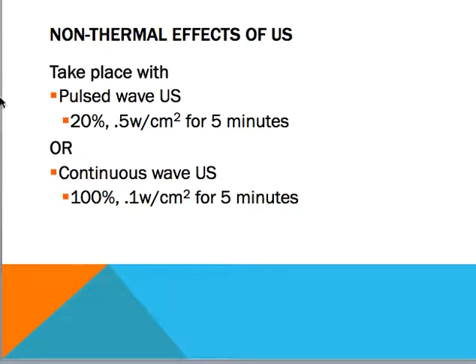And you should memorize this. If you're going to start using pulsed wave ultrasound with a patient, you would start with these parameters. Or if you have a machine that does not allow you to establish a pulsed wave at 20%, you can use a continuous wave, which is 100%, and you drop the intensity down to 0.1 watts per centimeter squared for 5 minutes, and that'll give you the same general output. The heat just won't accumulate. It just doesn't have a high enough intensity.